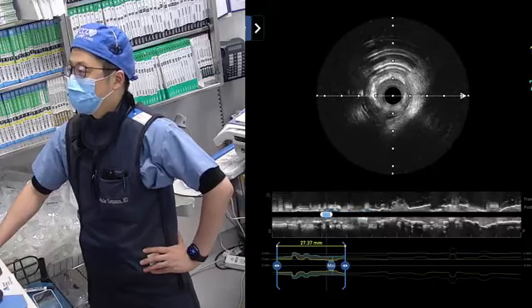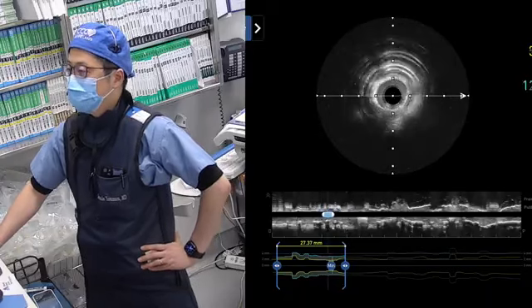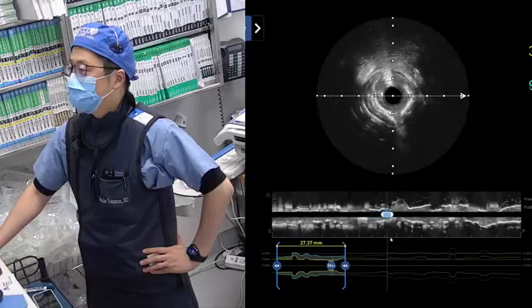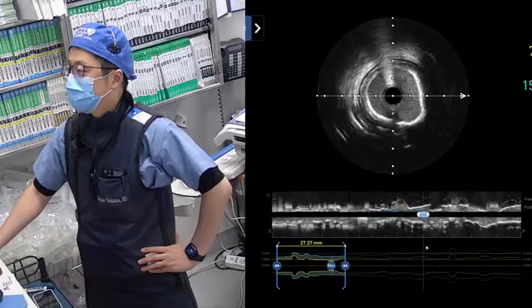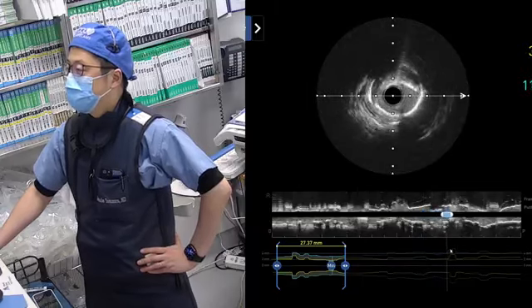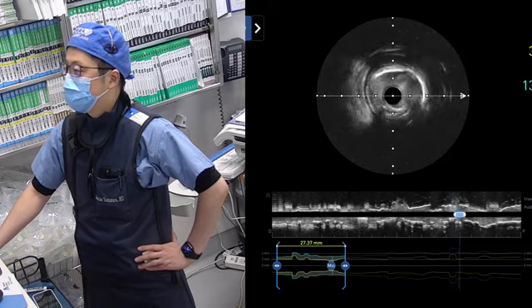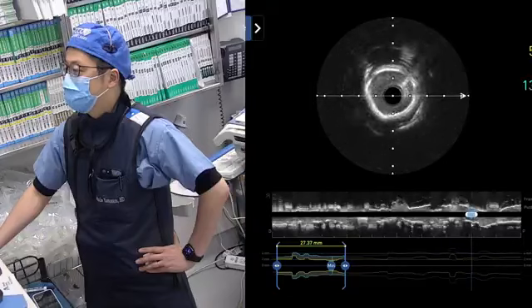No, we are just going with the balloon. Yeah. Go back, then we can check. So this is to the mid lesion, not the distal. Go to the mid. Okay. Sure. So this is the gap. Mid. Okay. Then come to the mid lesion, one diffuse calcified lesion. But at the mid, did it make some cuts? Yeah, I see some reverberation. It means the surface is shaved, but still like 360, very tight stenosis. Of course, yeah, we can try the balloon and see the expansion.